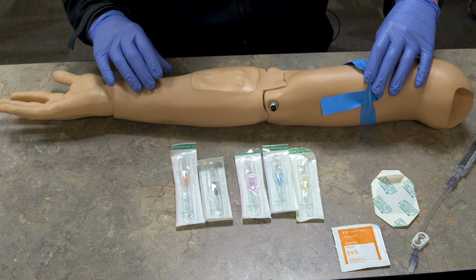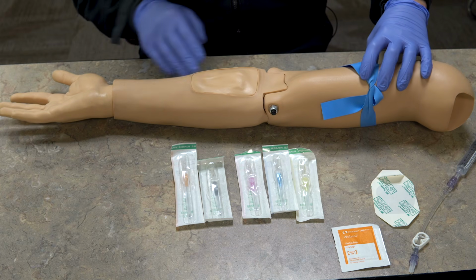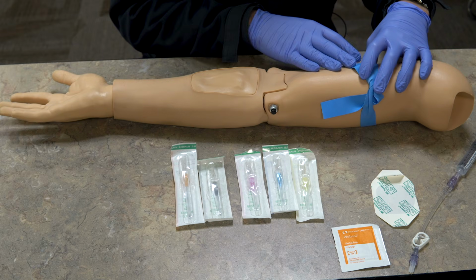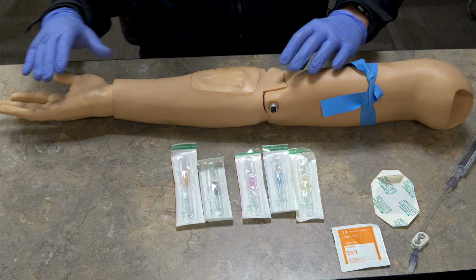So what the tourniquet is doing, it's actually cutting off the venous return from the arm. So you still have the arteries that are pumping blood into the arm, and then the veins are trying to drain the blood back to the heart, but because I have that on, some of them can't, and that'll actually cause the veins to plump up a little bit more on the patient's arm.